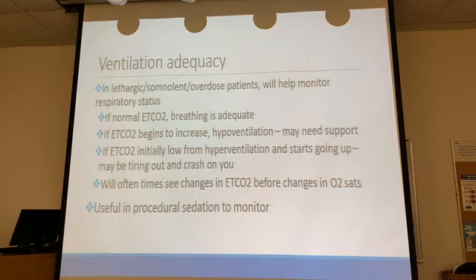Well, what happens if you're breathing 50 times a minute? If you've been doing that for 8 hours, probably not even 8 hours, you've been doing that for 1 hour, you're going to start getting tired. So initially you may come to this patient and they're breathing, you know, 30, 40 times a minute, and you hook them up to the end-tidal CO2 and it's low. It's down to 15. Well, you want them to be hyperventilating. They're doing what their body's supposed to be doing, but what happens if you start seeing it go up?